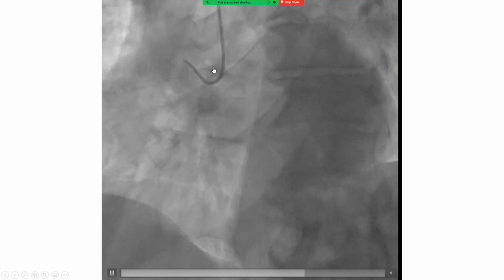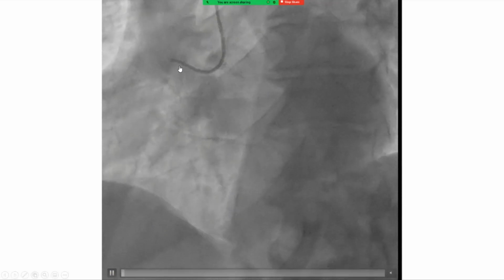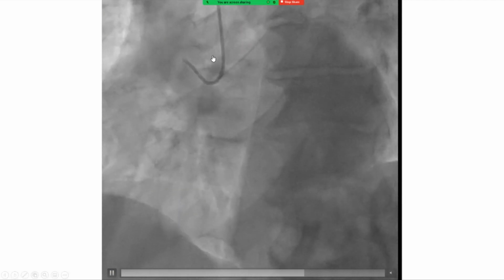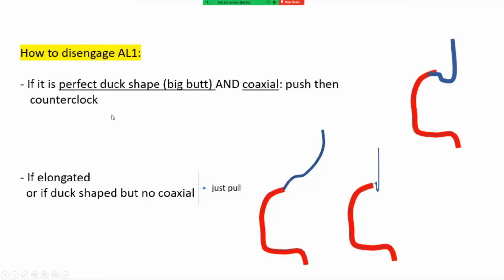This is what we did here. We pushed, then we counterclocked it out. You know, we clock to engage and we counterclock to disengage after you push it. Here is how we disengage Amplatz left. If it is perfect duck shape, meaning you see a big butt sitting on that aortic valve and coaxial tip with the coronary, don't pull. You need to push to prolapse that tip out a little bit, then counterclock.